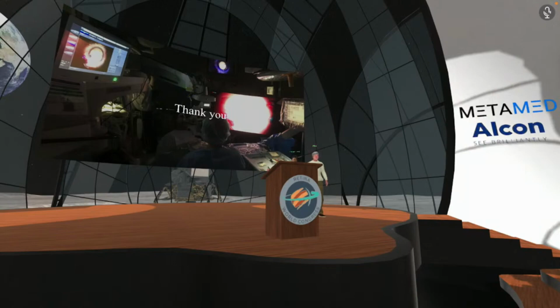Nas, a couple things that we've done that have helped, we'll turn the light intensity most of the way up to 100%, or maybe just greater than 100%. That's helpful. And as Dr. Imai has mentioned, he'll open up the iris of the camera.